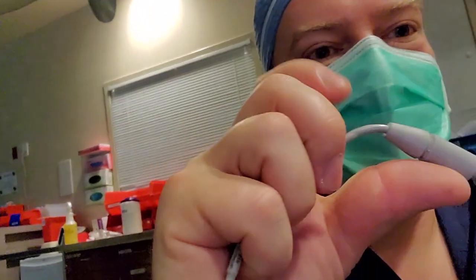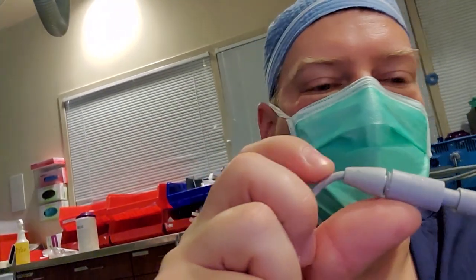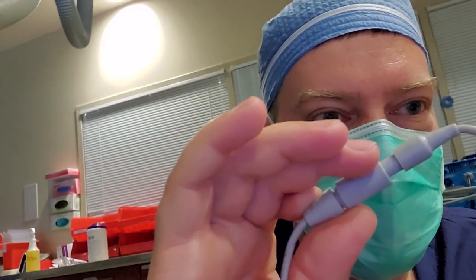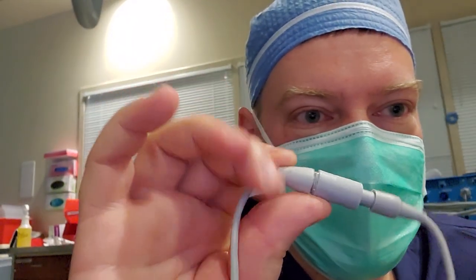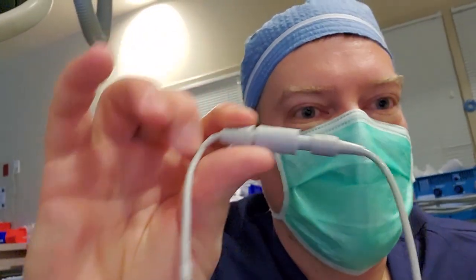oh boy, this could be one of my perfect examples. This cable right here, you can see it's been stressed right there, right after, I guess you can call that a strain relief, that rubber dongle. So the correct way to do this would be to detach the cable right there and then slide some dual layer shrink tube over it so that it overhangs this rubber dongle and the cable. And what you're gonna do is shrink it on there so that it creates a longer strain relief.